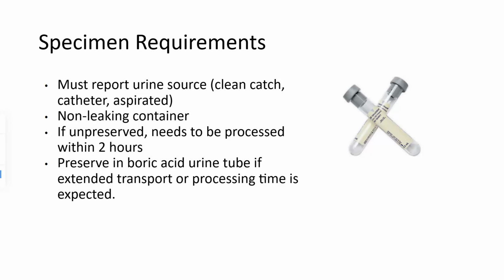So you have to report the source of urine. For most of our cultures, you want to report the source. Like stool, you don't report the source because stool comes from the digestive tract. That's pretty obvious where that's coming from. But like wound cultures, you want to report the source, and a lot of other types of cultures, you're going to report the source. Urine is no exception from that.